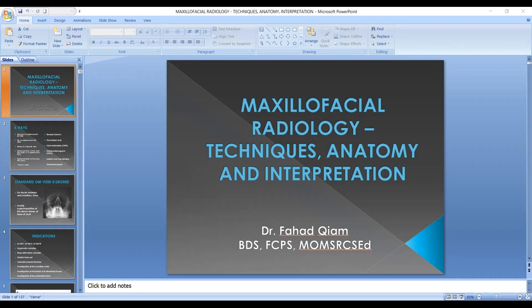And what I've decided to do is that the X-ray guidelines, on which X-rays you're supposed to advise for mid-face and mandibular trauma, I'm going to be doing those side by side. I thought at the end it will become just too much to do in the last session. So today when we're going to be discussing mid-face X-rays, we're going to be discussing some guidelines as well. So I hope you find that illuminating as I did.